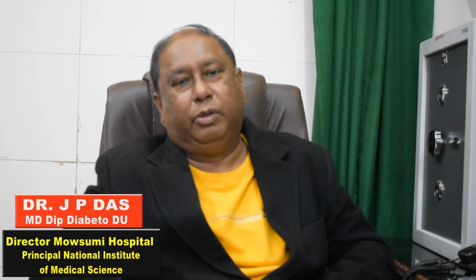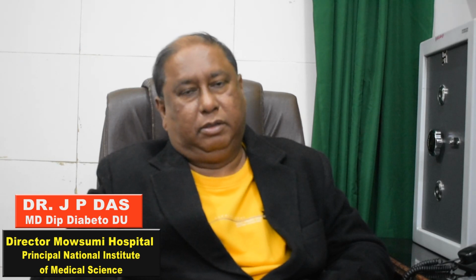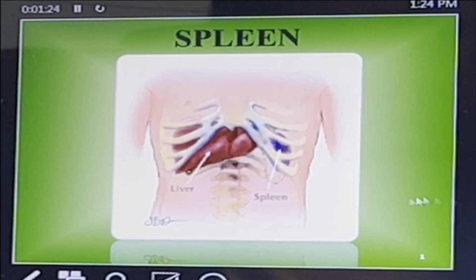Today we shall teach how to visualize the spleen in the ultrasound. We shall learn for visualization of spleen. So where spleen lies, this is spleen, okay?